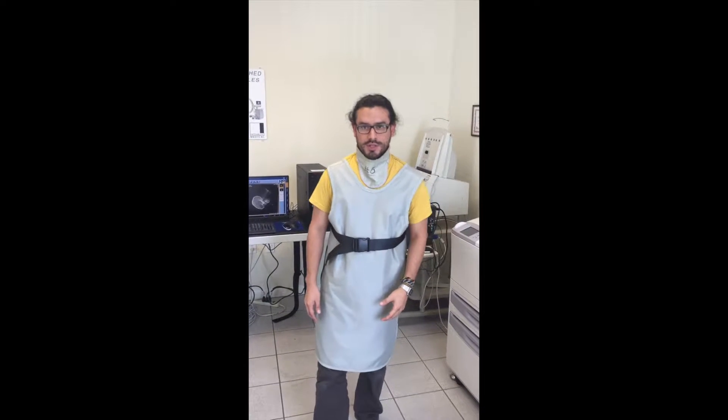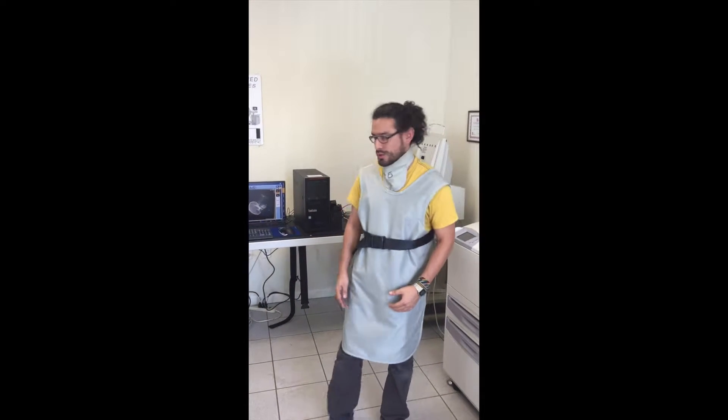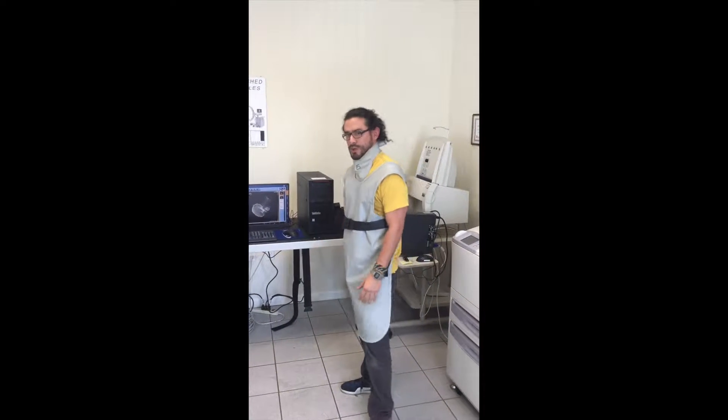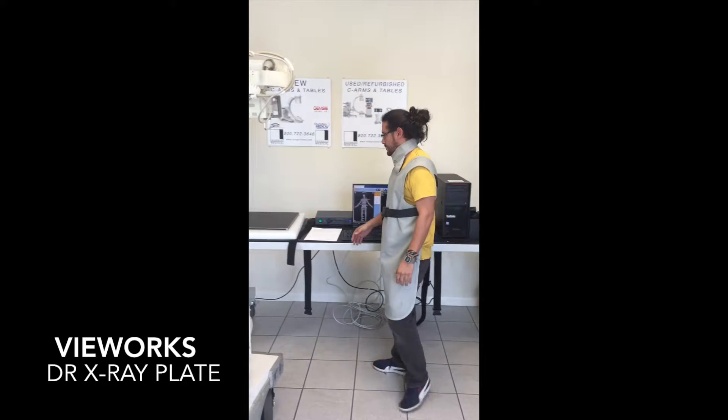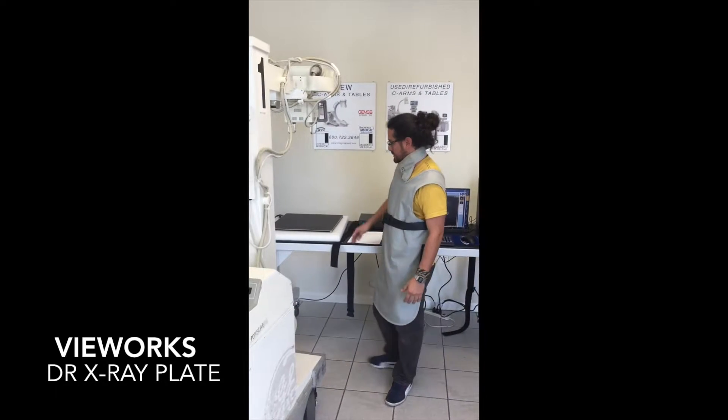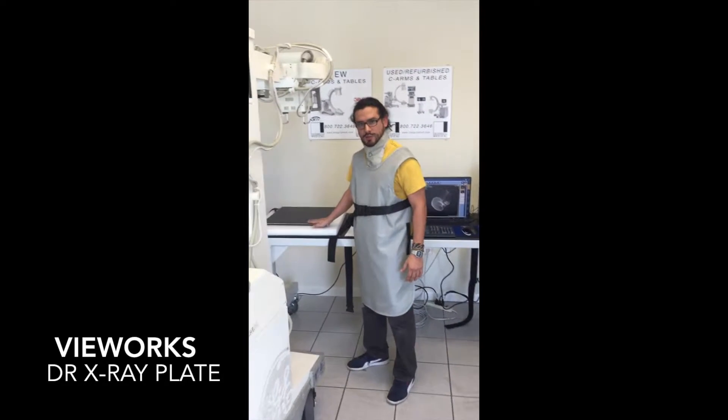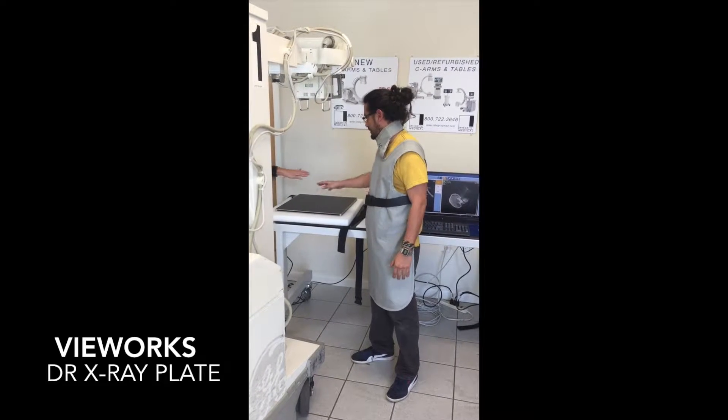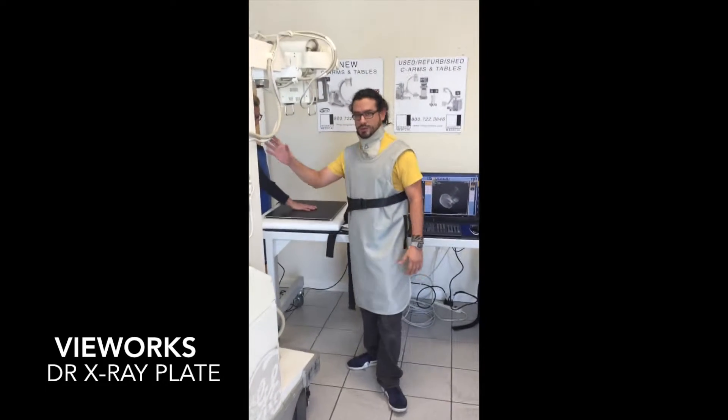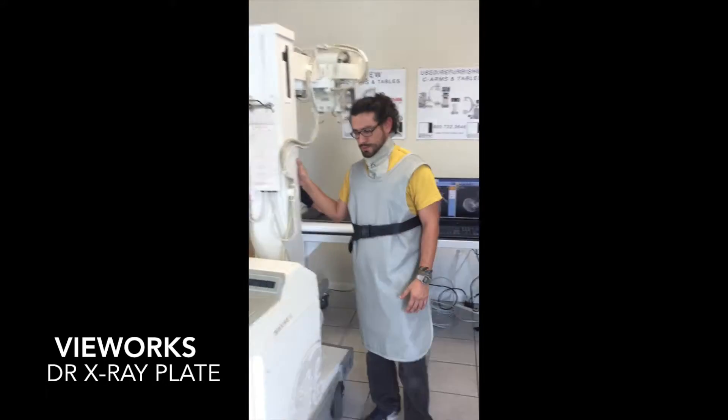Hi, my name is Willy from Integrity Medical. Today we're going to demonstrate the DR plate from Medlink. It's called the Alto. It's a tether plate, cesium, and we're going to be taking exposure of Miss Ashley's hand. We'll be using a portable AMX4.